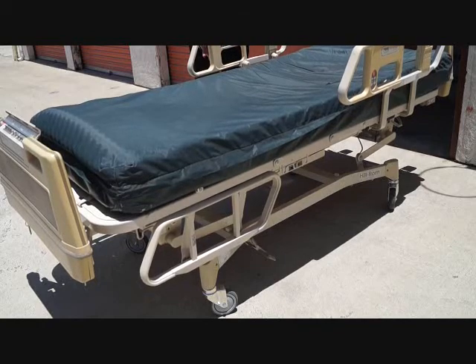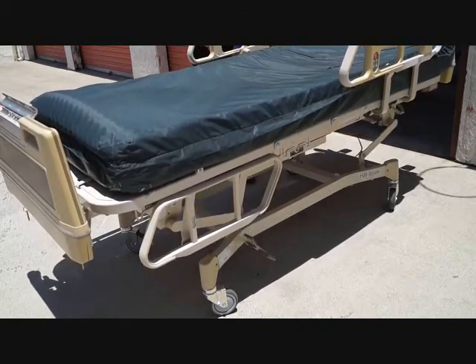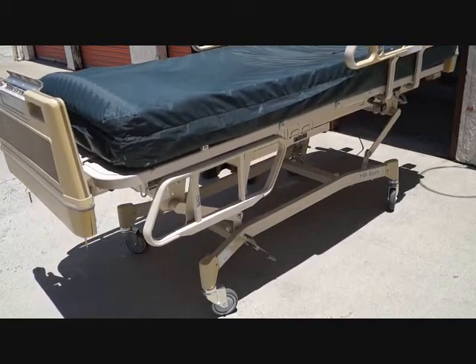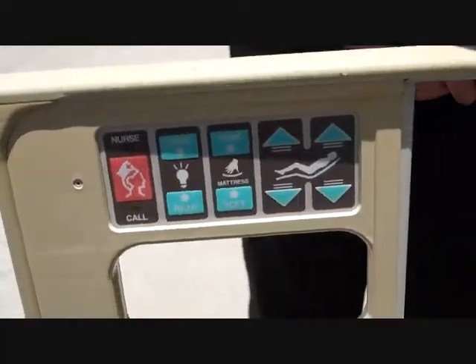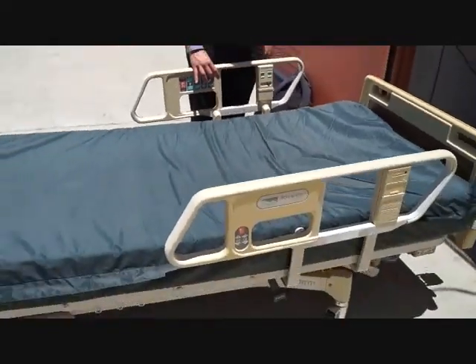You can see how high the bed will go up. But it's important for patients to be able to touch their feet on the ground when they get out of bed, so you can see how low. Go ahead, Henry, and take it back down, and let's show them how low it gets again. Controls for the patient right here can also work those controls.